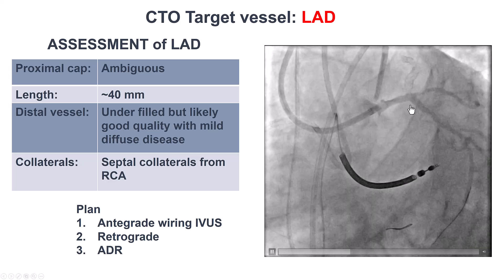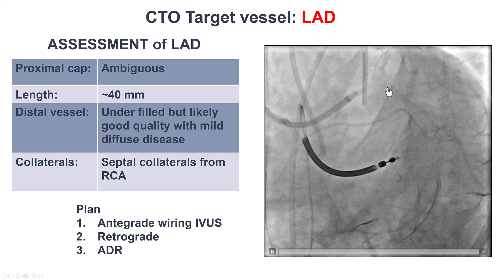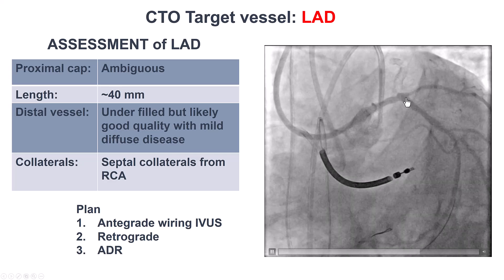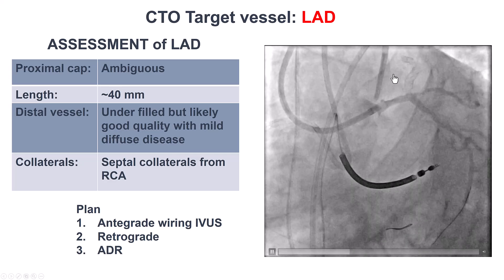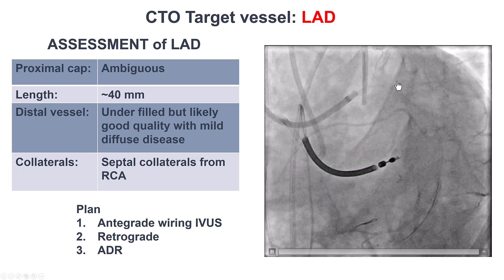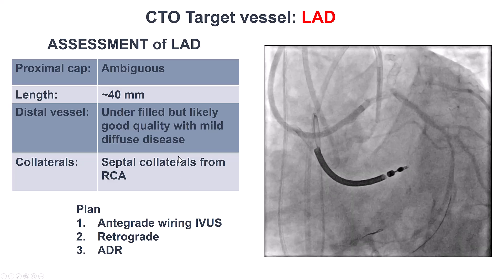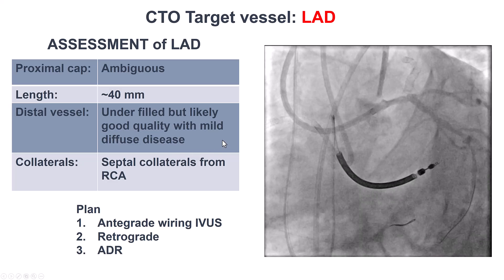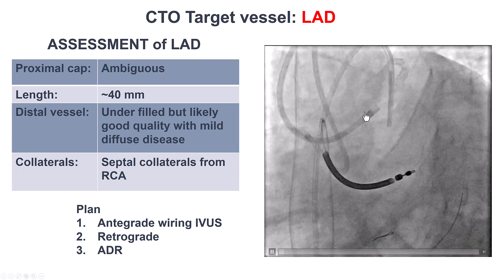So how to approach this lesion? This has a semi-ambiguous cap. We are not sure if this stump actually leads into the LAD, although we do have the stents that can serve as indicator of the vessel course. The lesion length was about 40 mm. The distal vessel was diffusely diseased, but that was likely due to underperfusion, and there was septal collaterals from the right coronary artery.